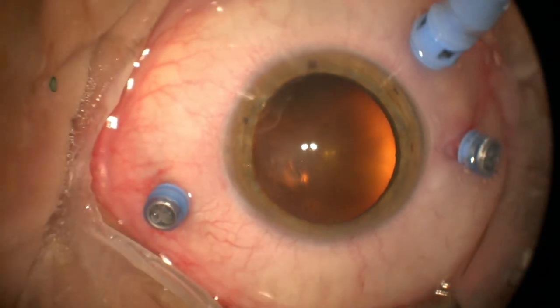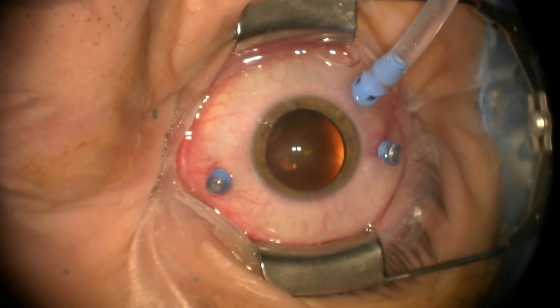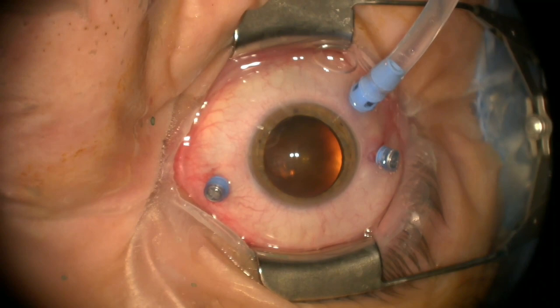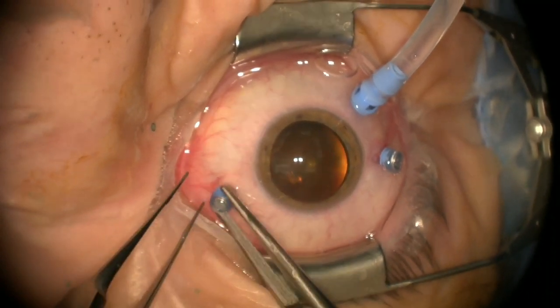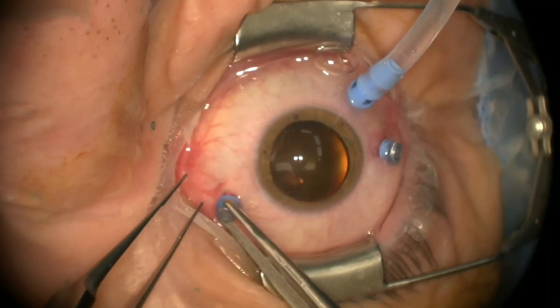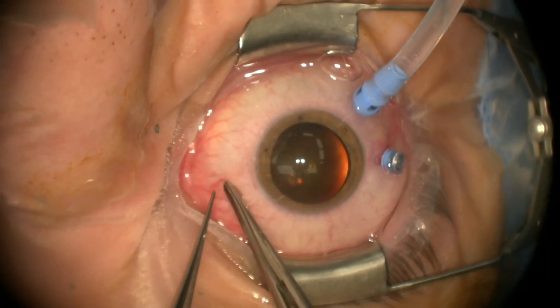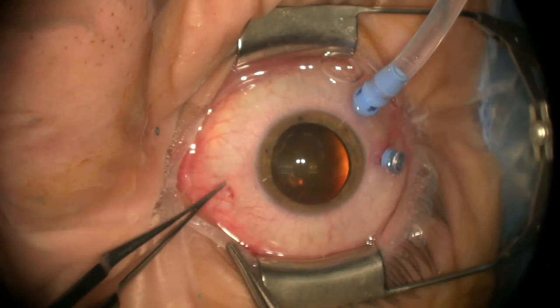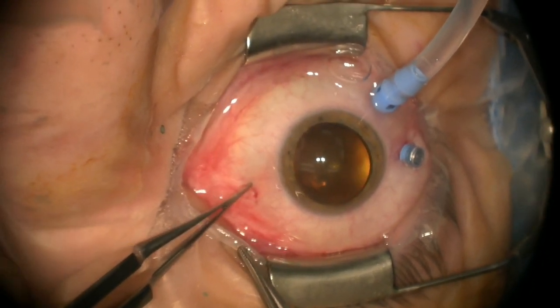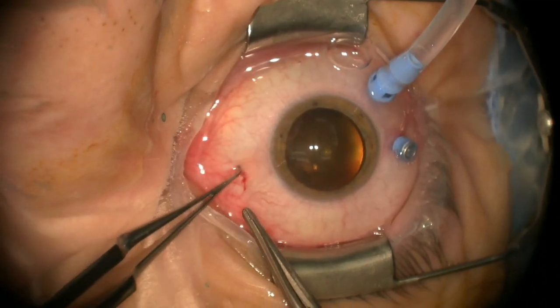Now let's go to, again, another very important part of the case. And that's pulling out the cannulas, making sure we don't have wound leaks. Can I have the other forceps too? I'll start with that. The light's on. So I'm going to pull this nasal cannula first. I'm going to pull it out the way I put it in, which is this way. Now remember that we have a tunnel here that's kind of like this. You can see that hole. I'm going to take my forceps, my more pointed ones, and press it right over the roof of that tunnel. And why do I do that? It helps collapse the wound.